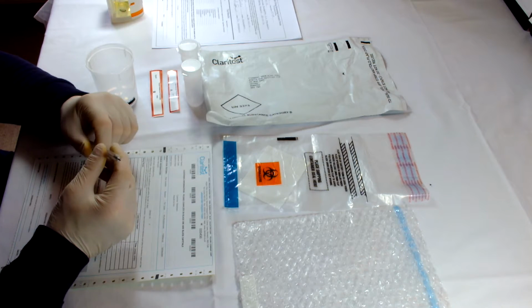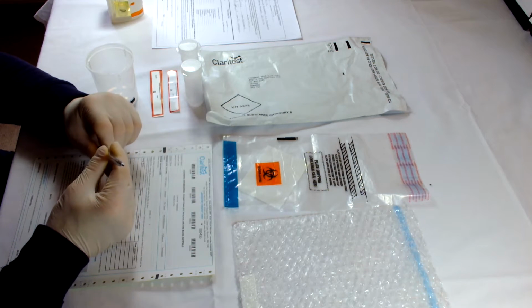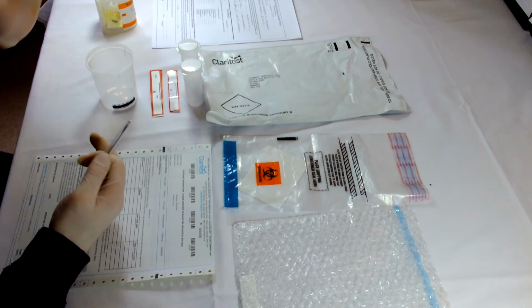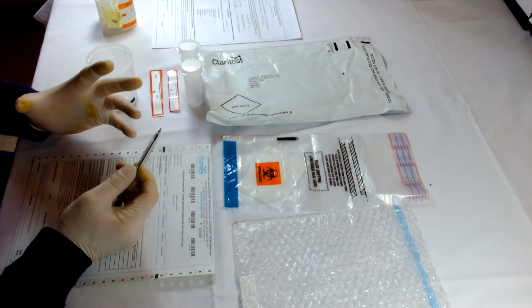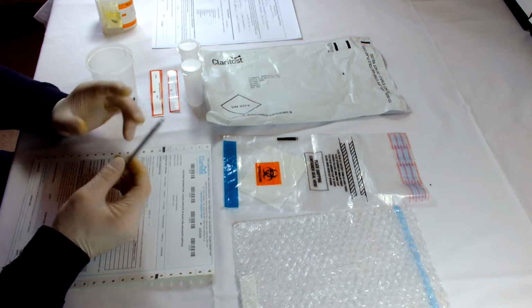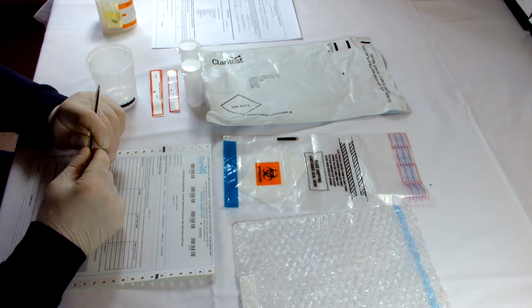It then asks what drugs we want the laboratory to test for. So if you've gotten a positive result for cannabis on the initial test, you might just want them to test for cannabis. If, however, you want them to do a screening for cocaine, you can do that, and you can ask them to test for other drugs.